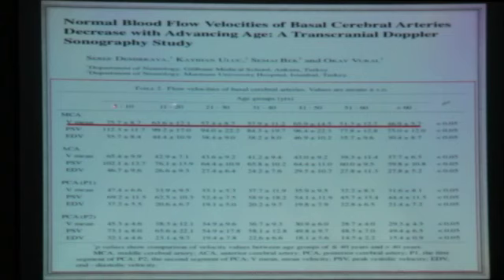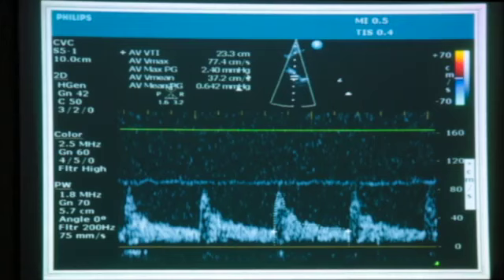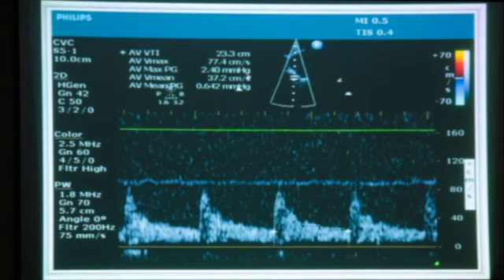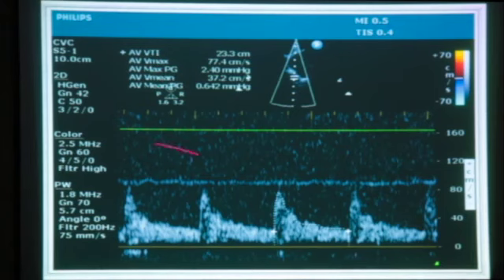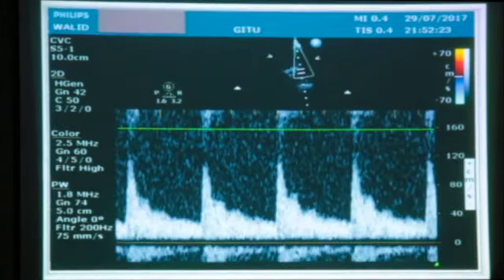These are the velocity cutoff tables showing mean velocity in the middle cerebral artery from age 5 to 10 years up to 60 years — the younger you are, the higher the flow velocity. We are mainly concerned with the middle cerebral artery, and if time permits, the vertebral-basilar system. To measure mean velocity, if your machine has transcranial Doppler software, it calculates pulsatility index and mean velocity automatically. If not, use a cardiac phased array probe set to aortic valve VTI mode — it gives maximum and mean velocity. You simply trace the flow waveform.